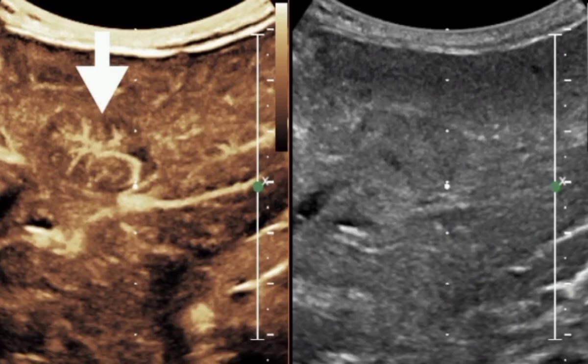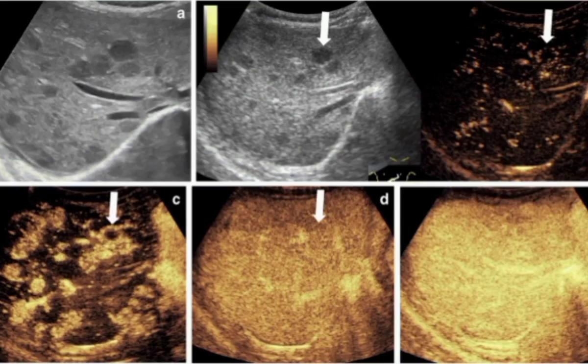Contrast imaging basically will require contrast agents. You use that to improve visualization of small blood vessels and vessels that are deeper in the body, improve tissue characterization for a better differential diagnosis, improve signal to noise ratio on Doppler examination.